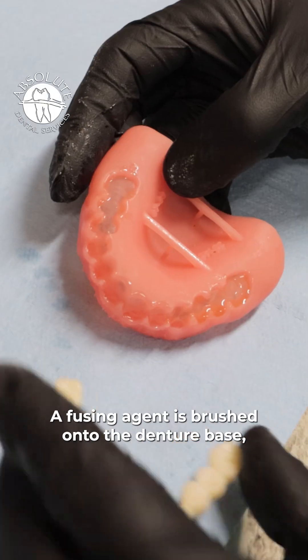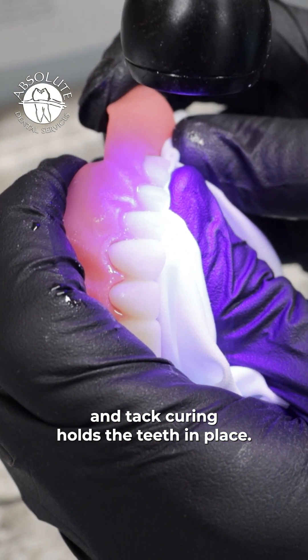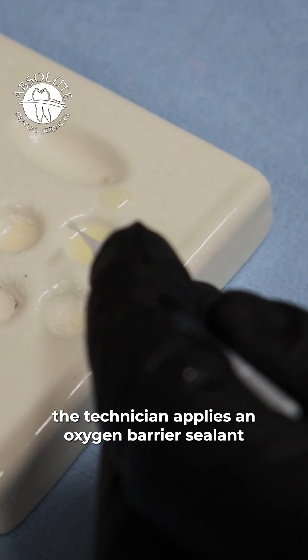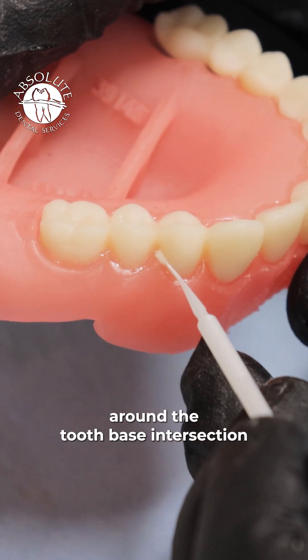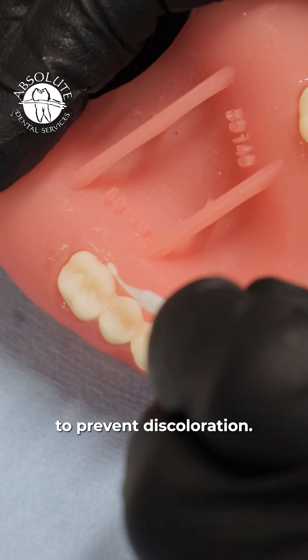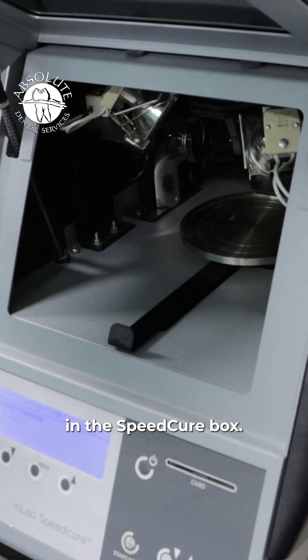A fusing agent is brushed onto the denture base, and tack curing holds the teeth in place. Then, the technician applies an oxygen barrier sealant around the tooth base intersection to prevent discoloration. Now, the fusing process is completed in the Speed Cure box.